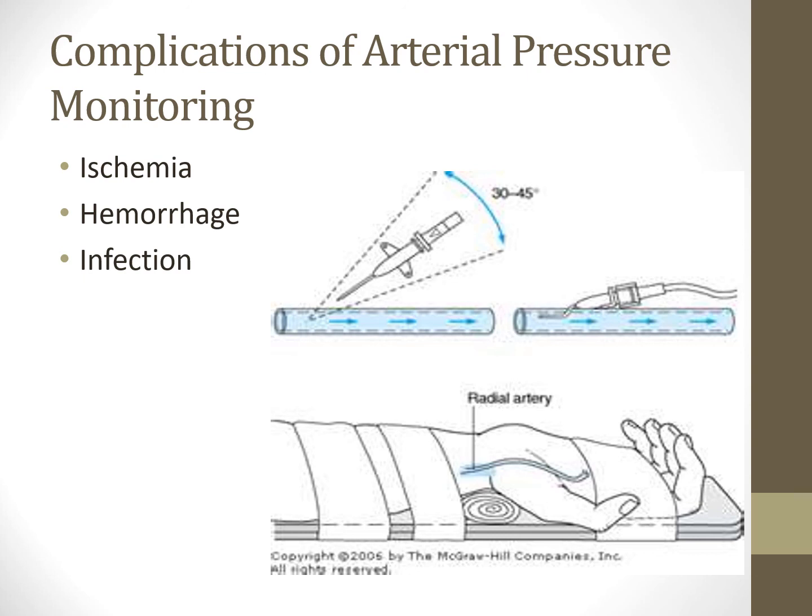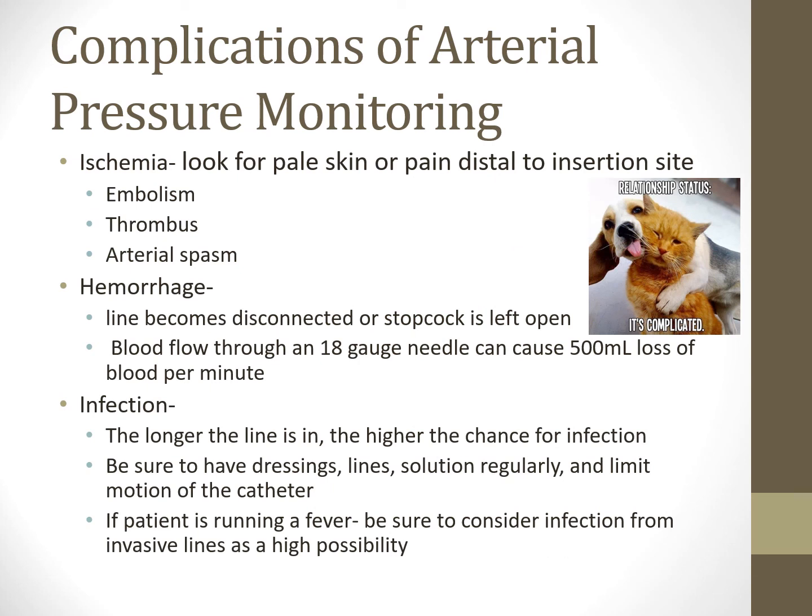So that said, if we're going to put an A-line in a patient and we just intubated them, instead of grabbing that initial gas, ask if they're going to put in an A-line, or if you're at a hospital where you're putting the line in, ask whether they want an A-line. Before you start stabbing away at their artery, maybe we just wait until we put a line in there, and then we can get that initial blood gas off of the line. So same type of problems there.